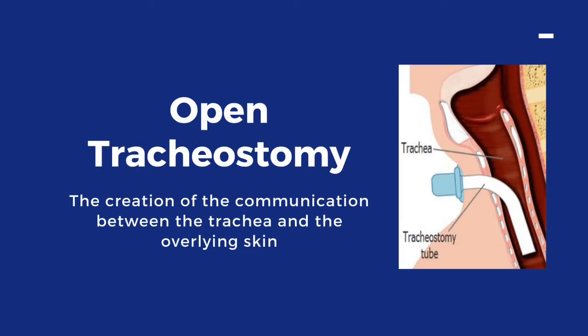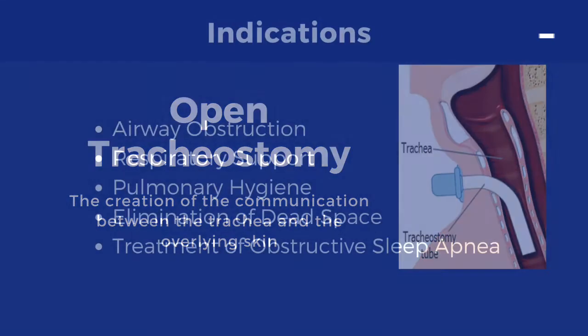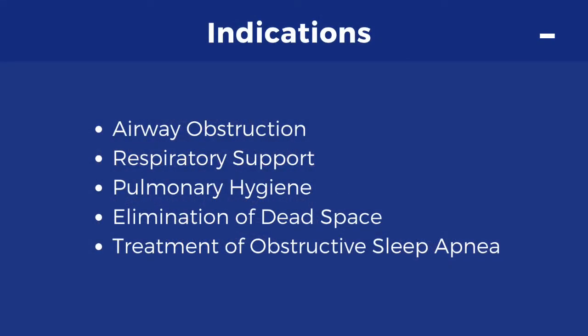Open tracheostomy is the creation of communication between the trachea and the overlying skin. It is indicated for airway obstruction, respiratory support, pulmonary hygiene, elimination of dead space, and for the treatment of obstructive sleep apnea.